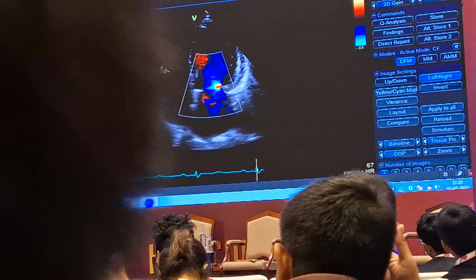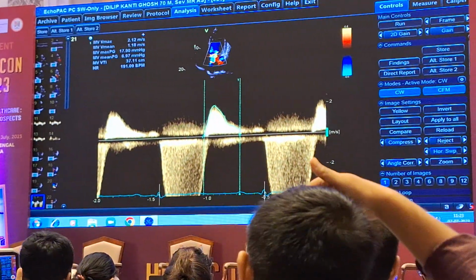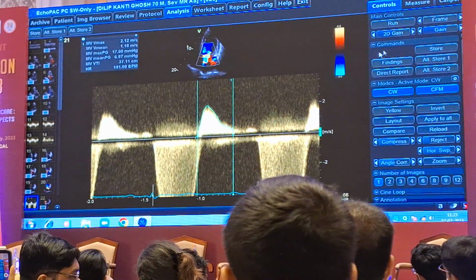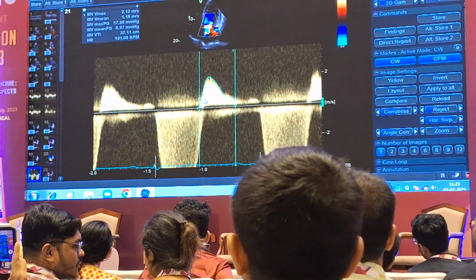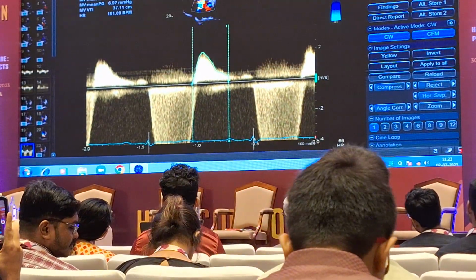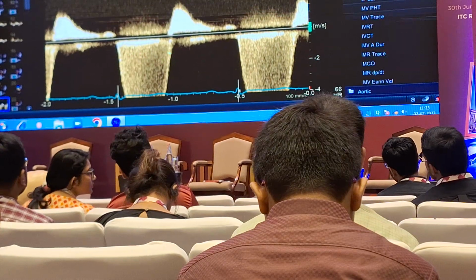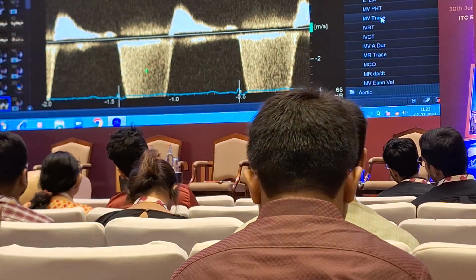There are different ways and issues. This is the Doppler over the mitral valve. You can see that it is very pansystolic and almost spilling into the diastole. There is a diastolic MR. So this is the diastole. This is the primary leakage, happening in systole, which you get as the pansystolic murmur. This is the flow out from the CW, this jet. In fact, a huge jet.